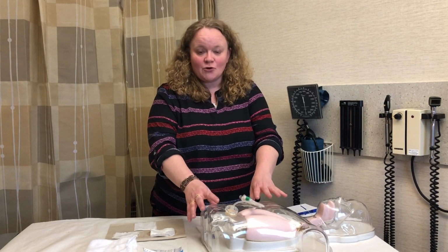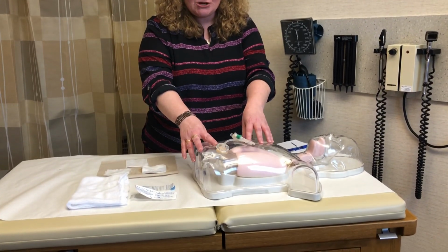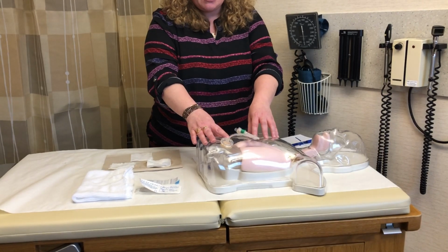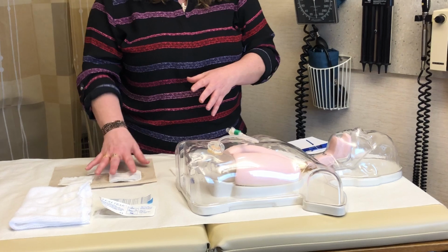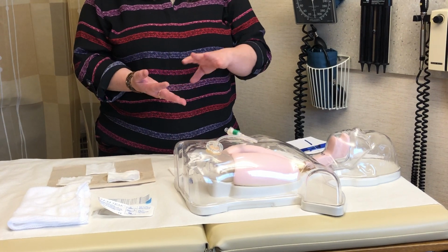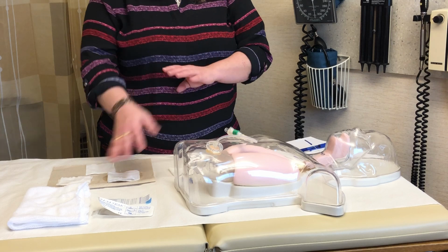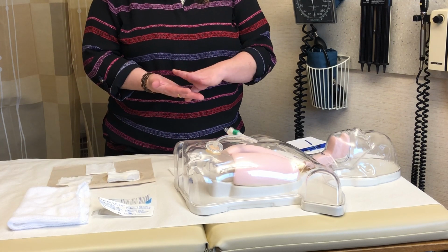Today we're going to go over site care for your feeding tube. Whether it be a PEG, a G-tube, or a J-tube, site care is the same for all of them. So today we're going to concentrate on a PEG tube in the stomach. First thing you need to do is obtain your supplies. You're going to need soap and water, gauze or a washcloth, and a new securement device.